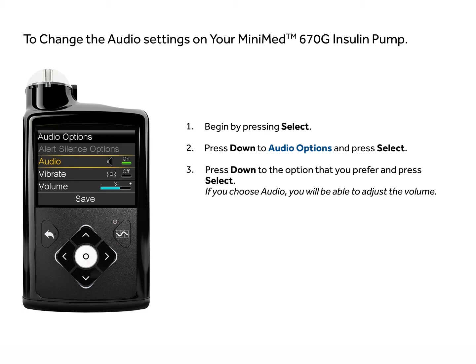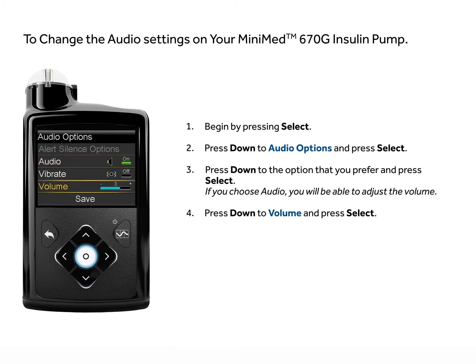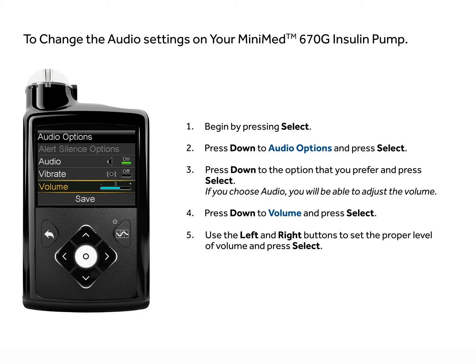If you choose Audio, you will be able to adjust the volume. Press down to Volume and press Select. Use the left and right buttons to set the proper level of volume and press Select. Select Save.